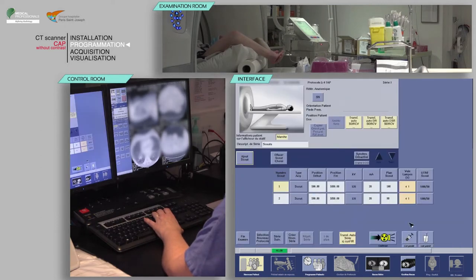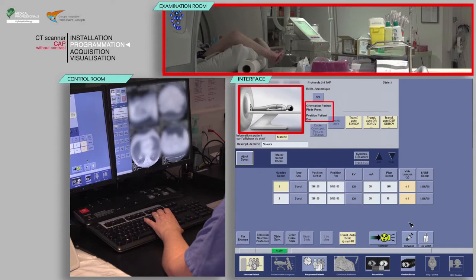Choose the appropriate protocol. Check that the patient's position on the table matches the one indicated. Note that the patient's orientation is feet first.